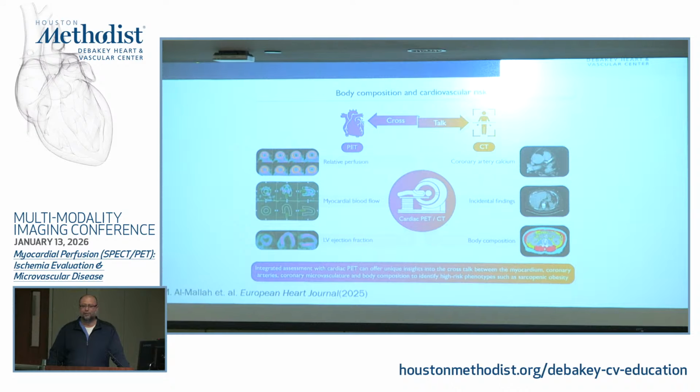But if you're going to the market to buy a PET CT now, you're only going to find PET CTs. That means you can do CT for almost all your patients and get information about atherosclerosis. Again, we do not look at non-attenuation-corrected images, due to some physics principles I talked about in the earlier lecture back in July.